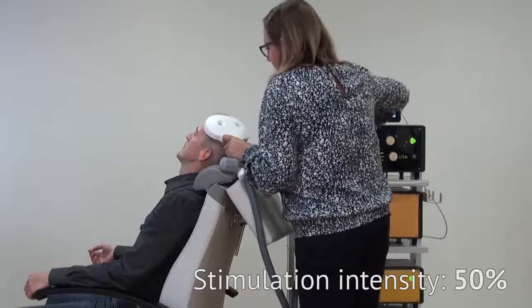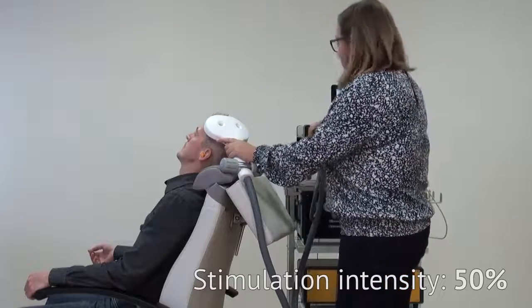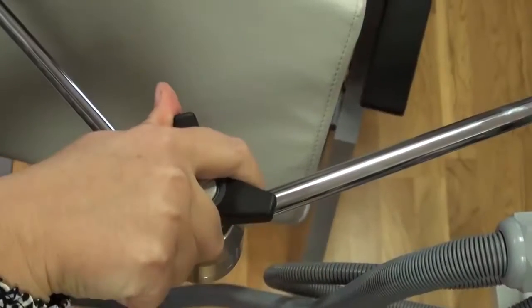This is the hot spot. Fix the position of the coil using the screw on the flexible arm.